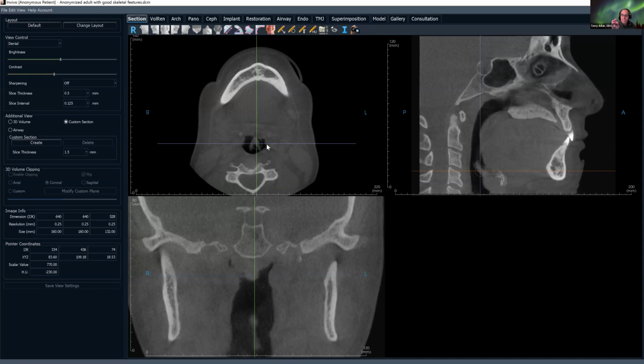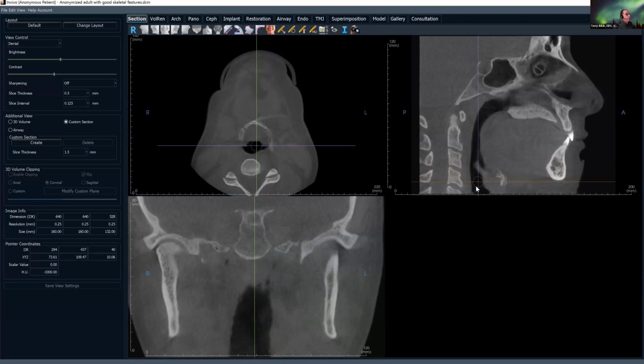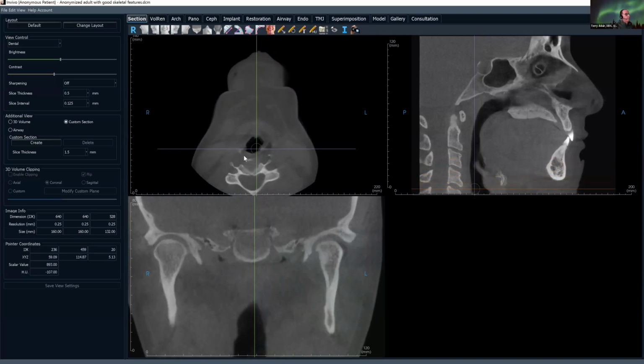And so it may appear just as a punctate little radiopacity that you may confuse again with calcification of the carotid arteries because they're going to appear in a similar area, now that we're in that C4 area. So you have the tonsilliths, you have the hyoid bone, you have the carotid artery calcifications, you have the ossification of the stylohyoid ligament, and then you have ossification of the thyrohyoid ligaments, which fall inferior. The most common one is probably not in this case here, as you scroll to the inferior right here. So we're at the inferior aspect of the hyoid bone.